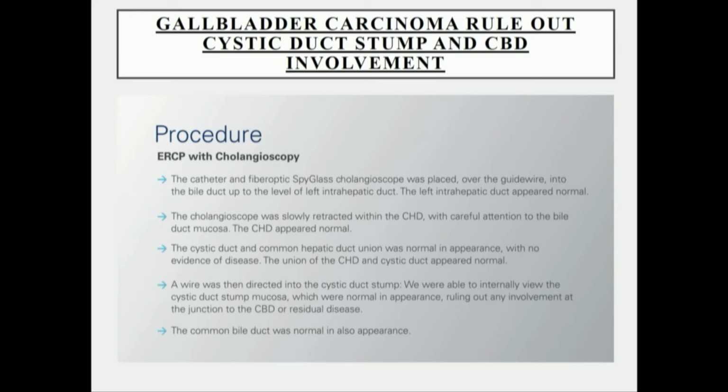It's valuable information. Previously, you would have had to resect that common bile duct, do a hepaticojejunostomy, which adds to morbidity, and assess for margins in the postoperative specimen.